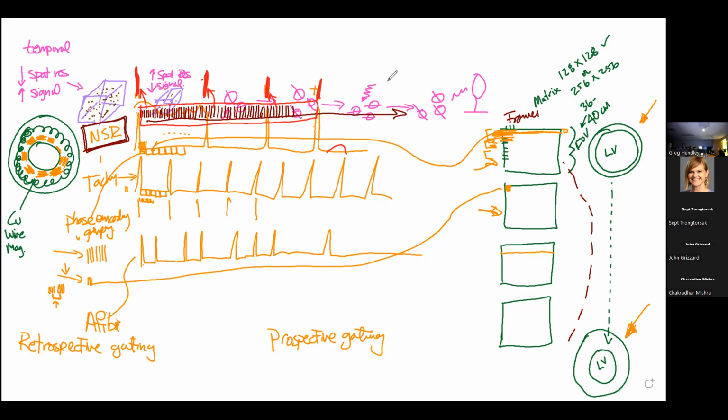So most of the scans, when you are performing them, are using retrospective gating because the RR interval is regular, right? And that works here too. It's the same thing if it's tachycardia. It's just grouping these together in smaller intervals than up here when it was doing this, right?